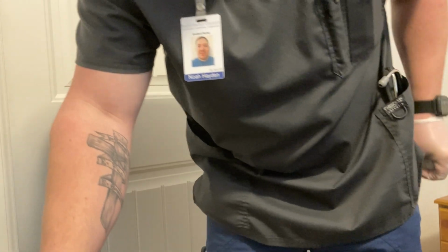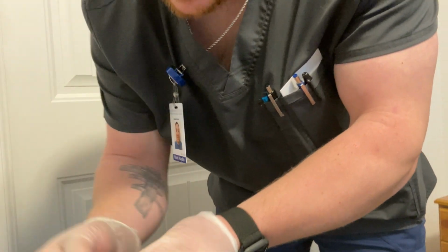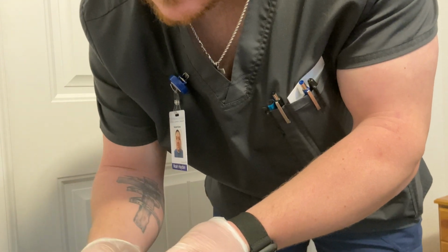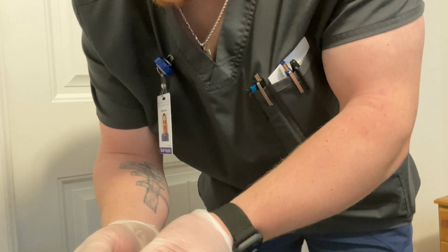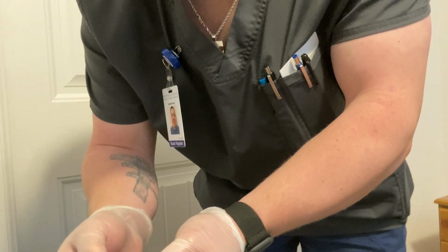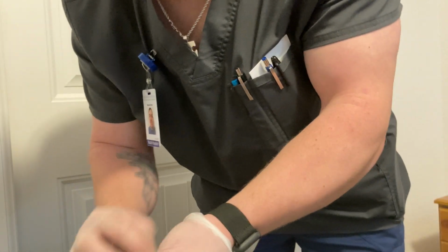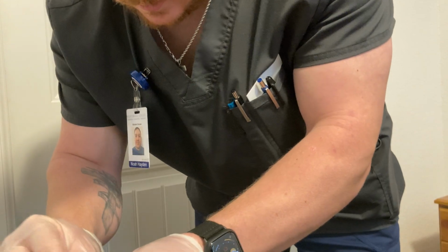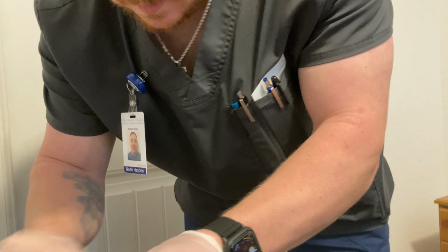Since this is a reused bottle of 10,000 units of heparin, I'm going to verify in his chart that he needs 1 dose of 1,000 units of heparin solution. This is a bottle with 10,000 units per 10 mLs, which means that I will need 1 milliliter of solution in order to get 1,000 units of heparin. I will clean the top of my bottle with an alcohol wipe.